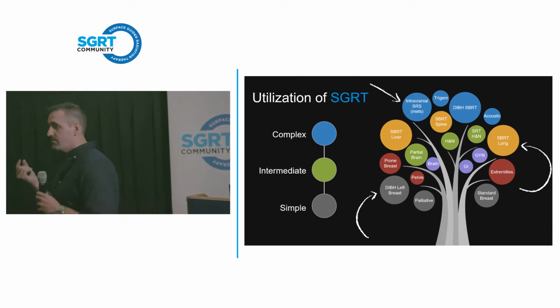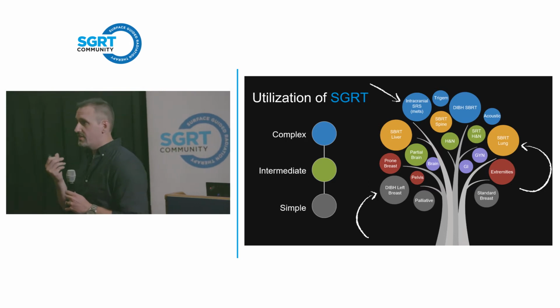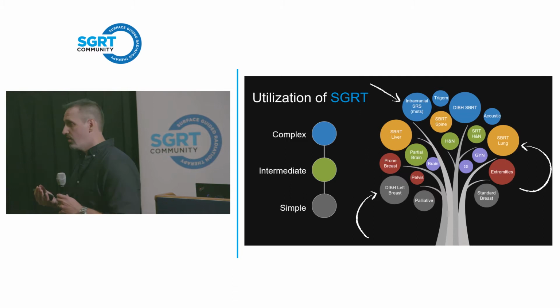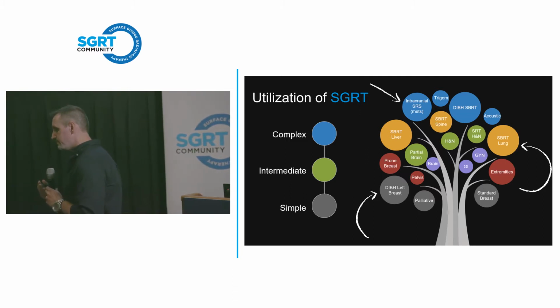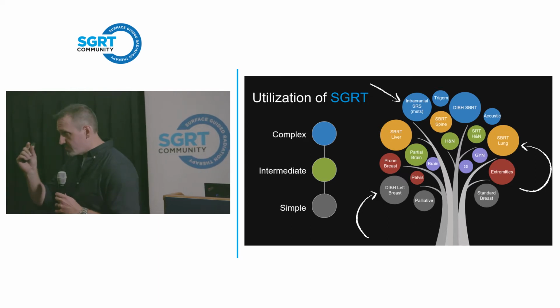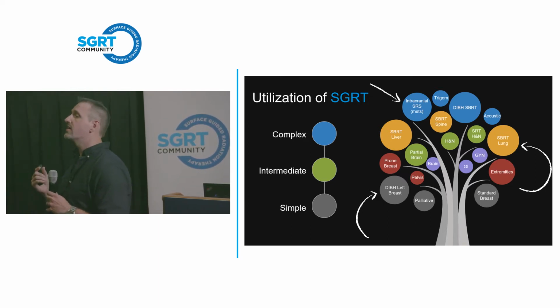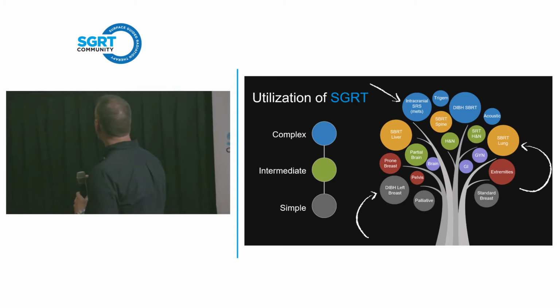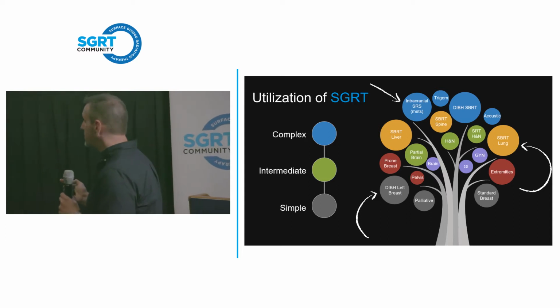we have very small electron fields that we're treating on faces and the inner canthus of the eye or the crease of the nose. And if you have a mentally handicapped patient or a patient that is partially demented or suffering from Alzheimer's, you can set up this very small field, but as soon as you leave the room, if they're talking and that field's going everywhere, you're not treating it. And so we use that even for electrons. Everyone gasps in horror and dismay when I say that, but I didn't hear from you guys.